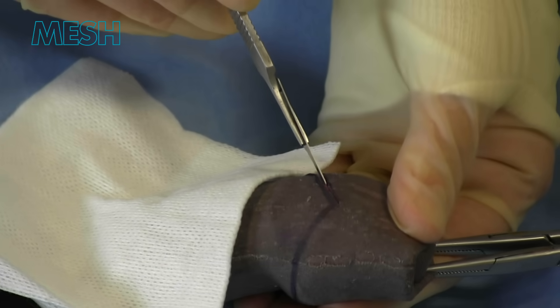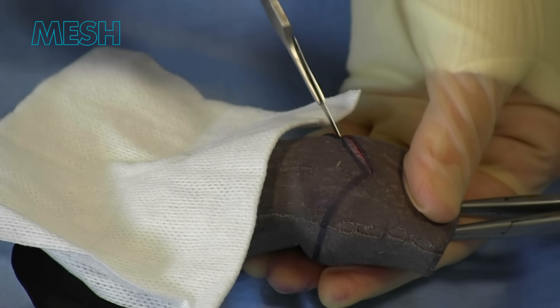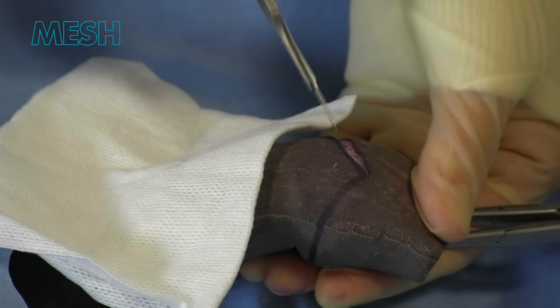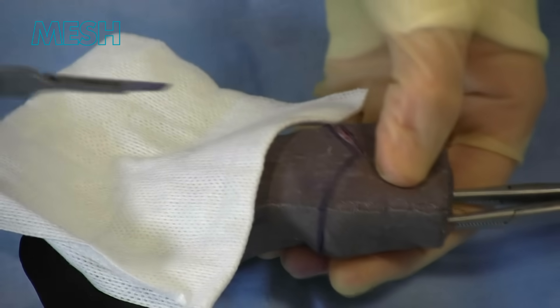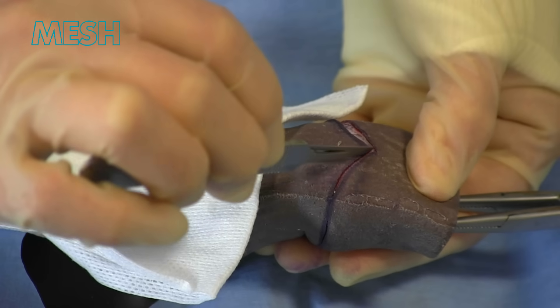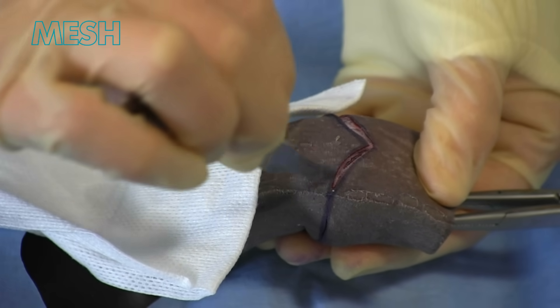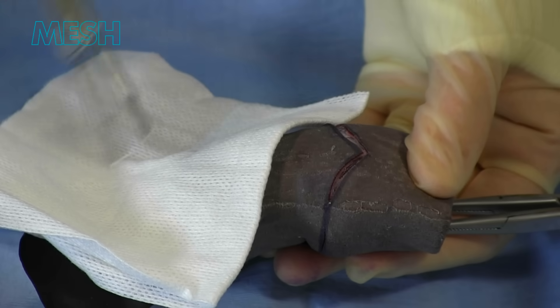This is the outer incision. The penis is then angled to allow the frenular incision. At this point it's possible to incise the frenular artery, which can cause a fair amount of bleeding, which can be controlled with bipolar diathermy.